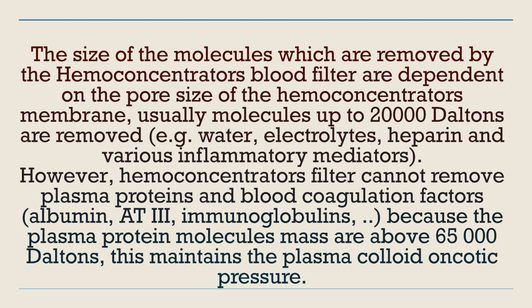However, the hemoconcentrator filter cannot remove plasma proteins and blood coagulation factors, albumin, and immunoglobulin, because the plasma protein molecular mass is above 65,000 daltons. These maintain the plasma colloid oncotic pressure.